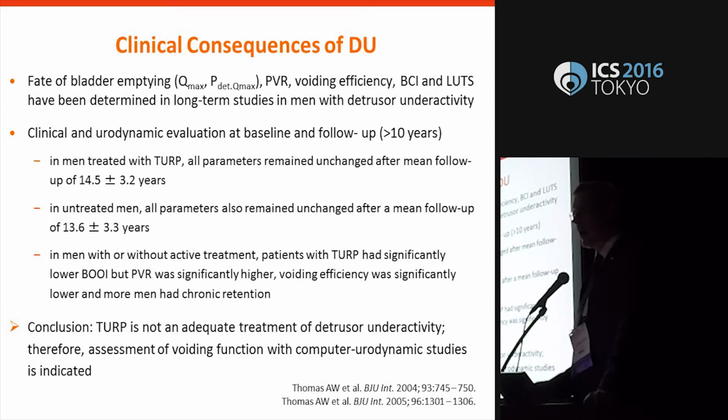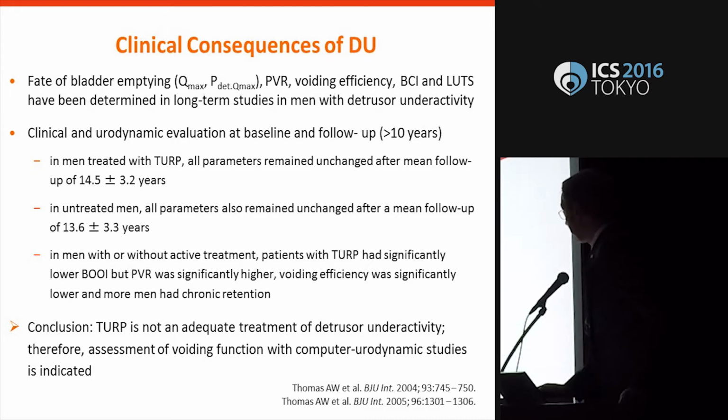And in the EU guidelines, and I was one of the committee members, we recommended that a patient older than 80 years of age should have a urodynamic investigation before TURP, just to exclude detrusor underactivity.